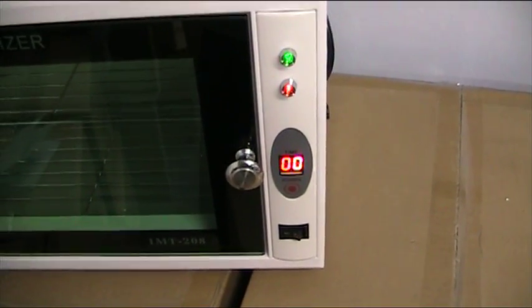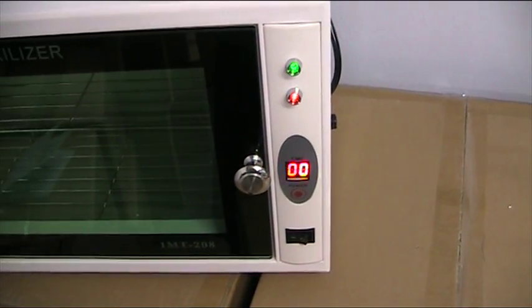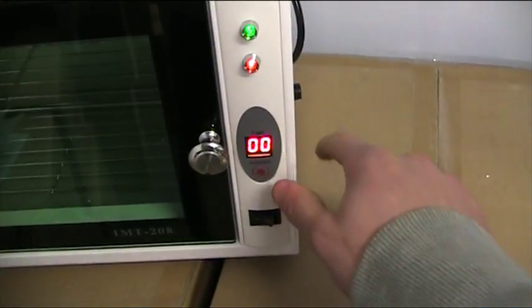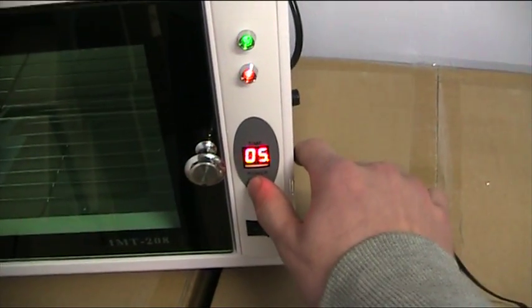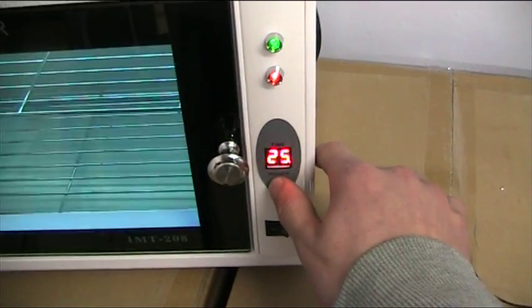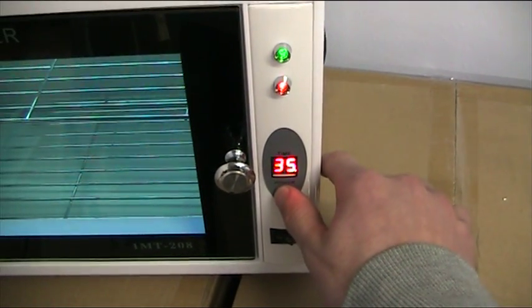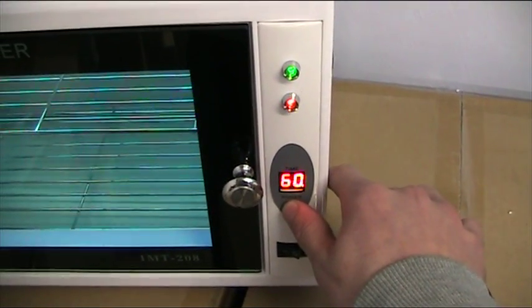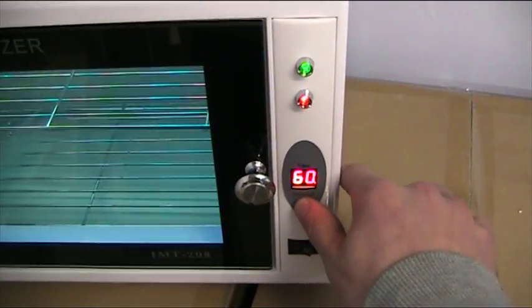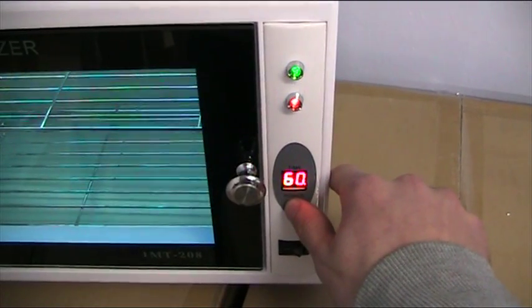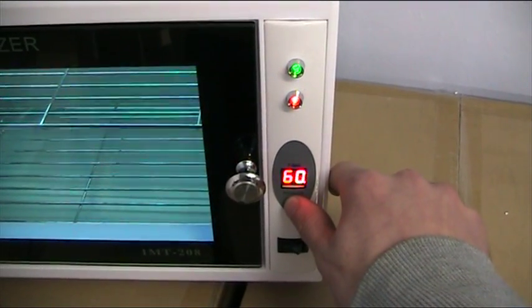The timer can be set at 5-minute intervals up to an hour. Once it reaches 60, if you press it again it will turn the unit off.